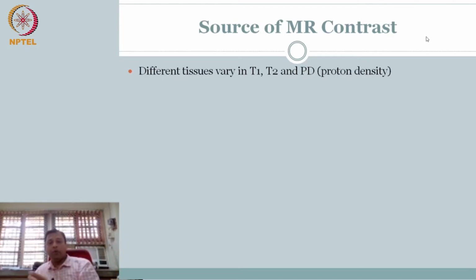So there is a time to echo that we talked about, so that is under our control. Third one is a similar thing. After time to echo, after the excitation is off, I have to repeat the experiment. So how long do I wait before it all comes back to equilibrium, and then I repeat the experiment? So time to repeat, right? That is under your control.